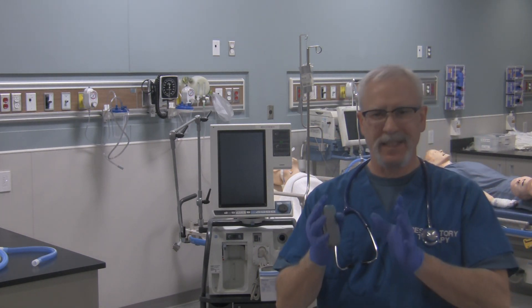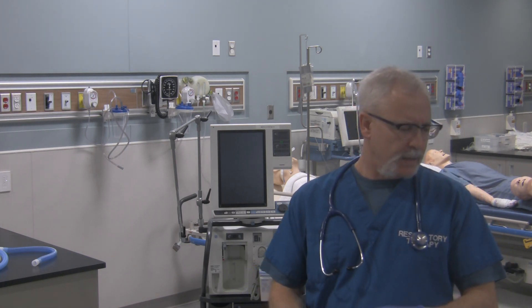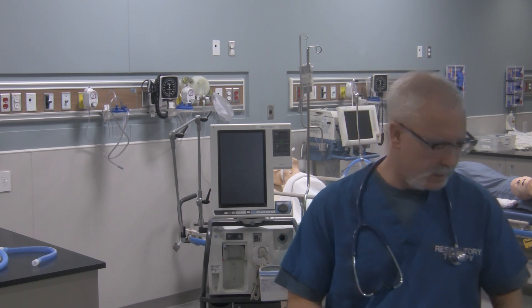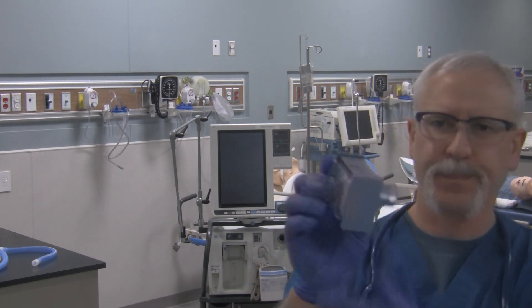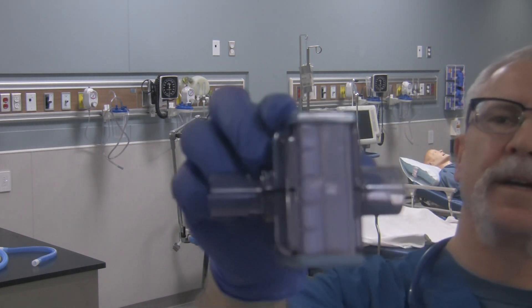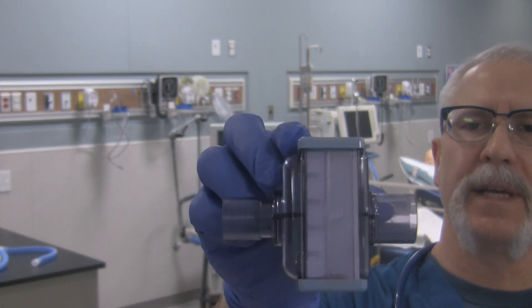It's pretty much the exact same process to circuit this ventilator as it is any other ventilator, but there's a couple of different things with this one. First thing is there's an inspiratory filter on the ventilator — that's this filter right over here. It's got an arrow, and there's an arrow right here indicating the direction of gas flow.